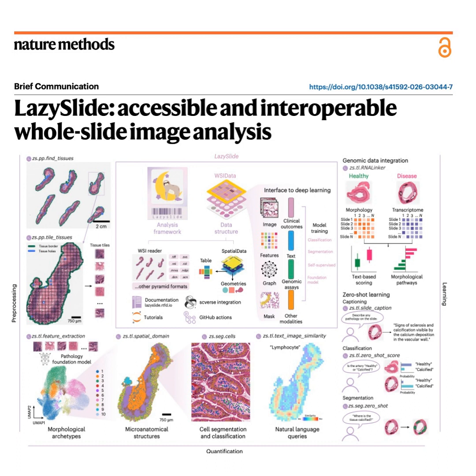You got it. Because biological tissue is usually stained with hematoxylin and eosin. Those are the rich purple and pink dyes. The tissue itself is highly saturated. Oh, I see. So by isolating just the saturation channel, the biological material mathematically pops against the low saturation glass background. That is so smart.